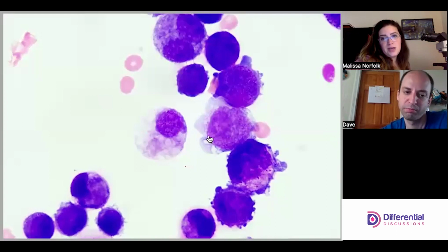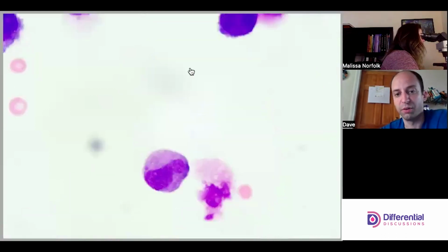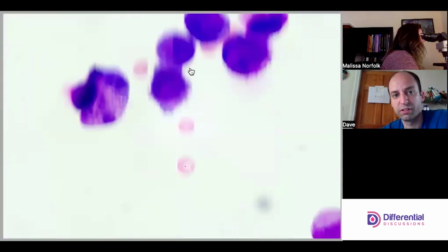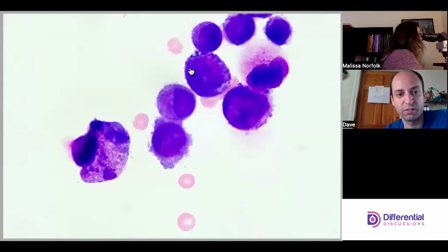These you can't see anything. And that's just not the stain. That's the cell. So yeah, everything in this field is going into other. And it looks like just about everything in this slide. Horrifying, right? Let's see if we can find something that's semi-normal.